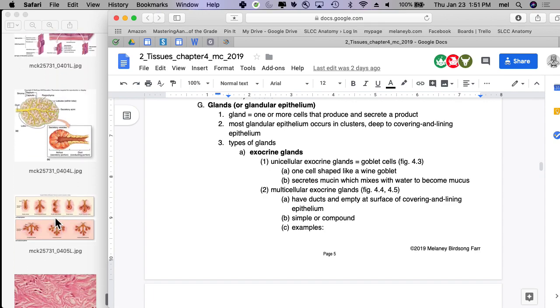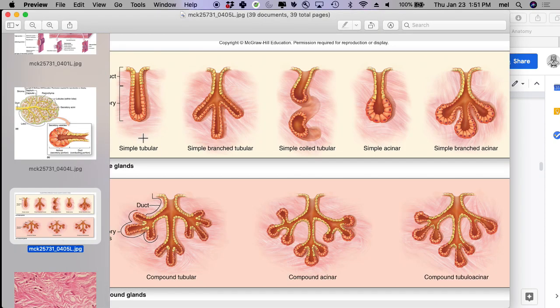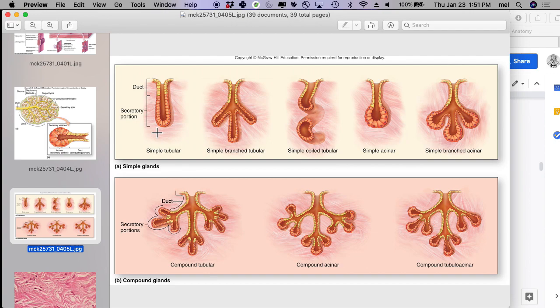See if it makes sense to you that exocrine glands, now, you do not have to know all of these individually. You just have to be able to recognize them as exocrine. And so what you are seeing is they are going to lead to a surface. So what you tend to see is they are curved below the surface and have a duct that leads toward the surface. From a top view, the duct would look like a pore. Does that make sense?